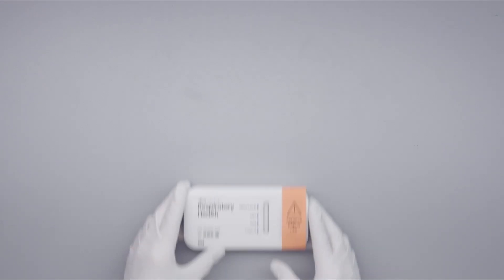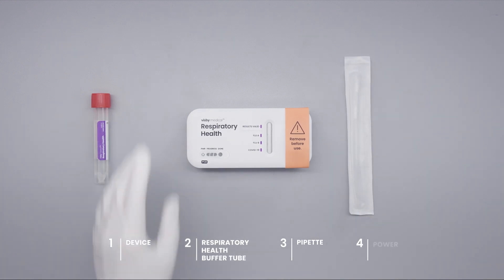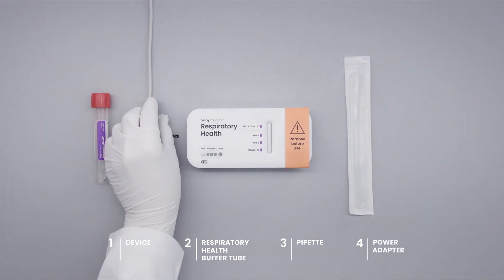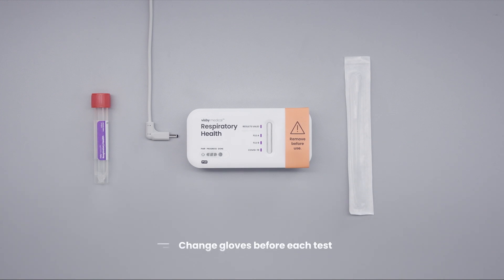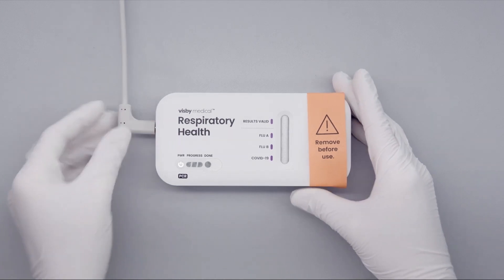Begin by setting up your workstation with a device, respiratory health buffer tube, pipette, and power adapter. Change gloves before each test to avoid contamination and keep your workspace clean.